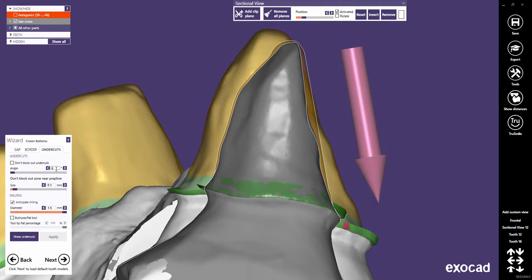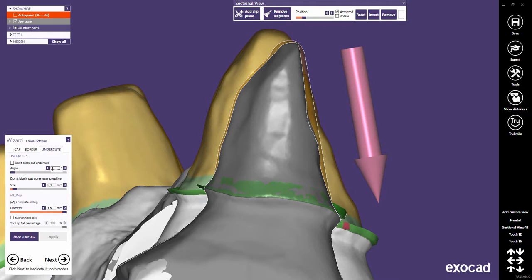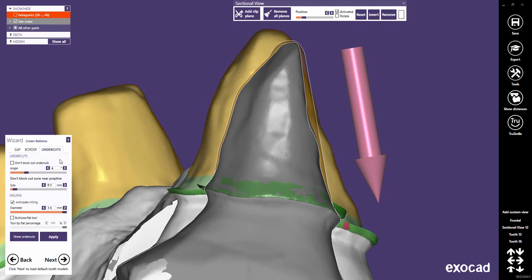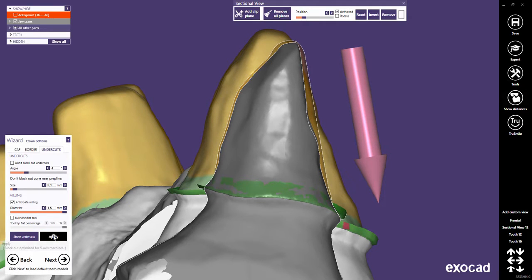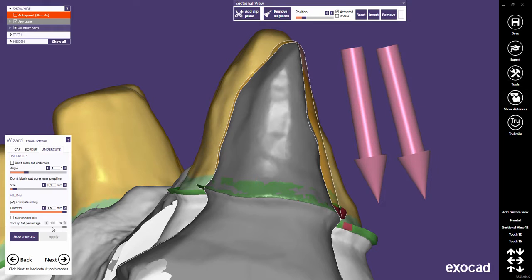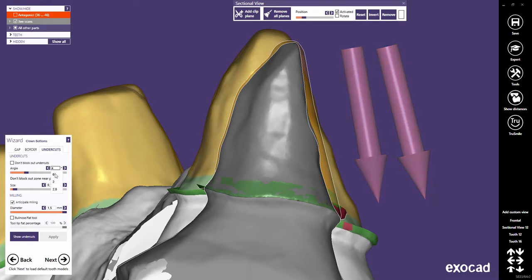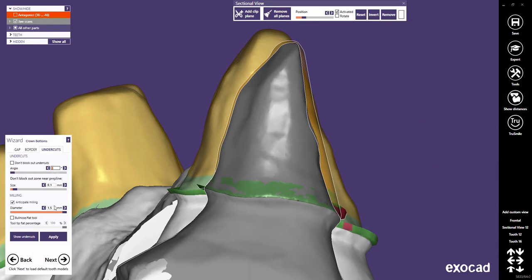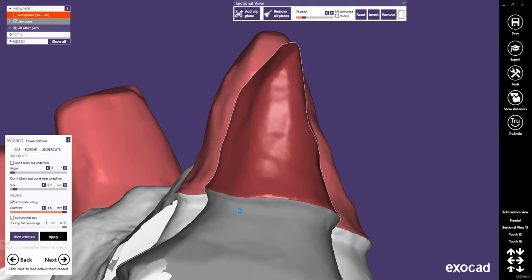Undercuts are always blocked out parallel to the insertion axis unless you explicitly choose an angle that should be applied for blocking out undercuts. For instance, this might be done when conical tools are used in the CAM. Let's come back to the default settings.